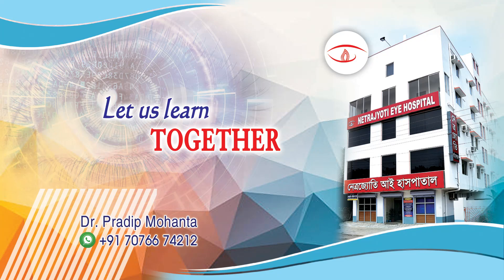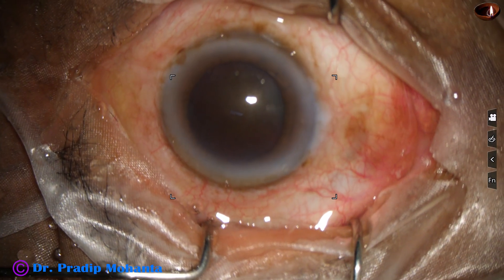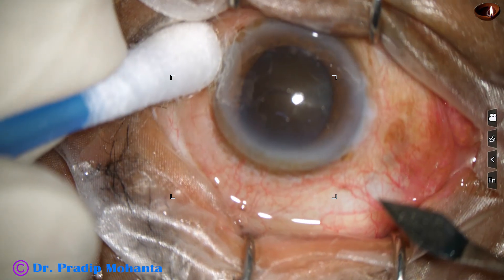Friends, in this video we are going to learn phaco emulsification of a hard cataract. This is a totally unedited recording — you are not going to miss anything.